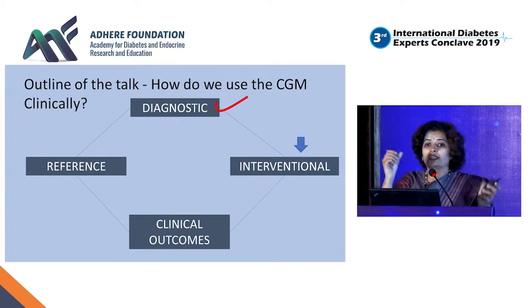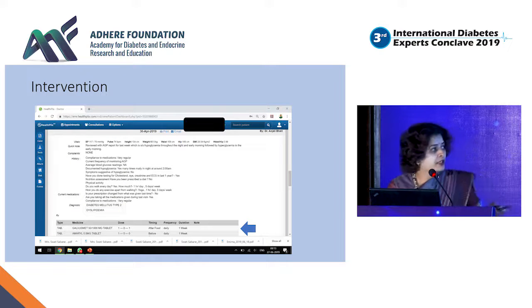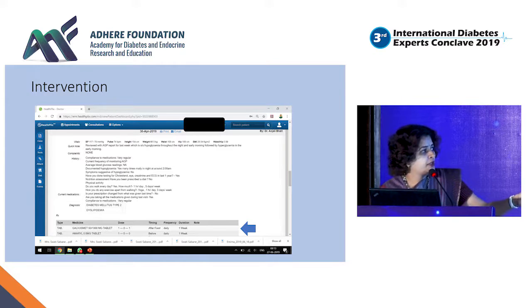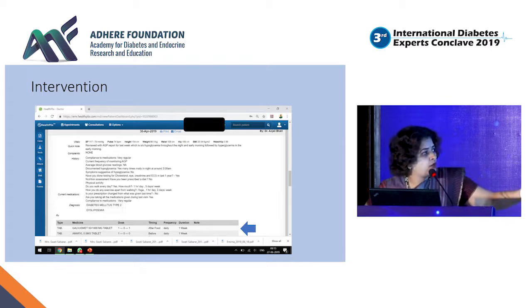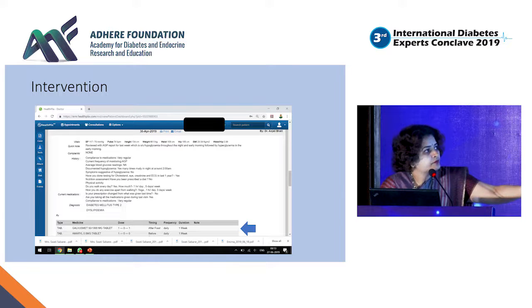Okay, I diagnose the variability is small, the interdecile variability high. So what? So what's the next step? Look at her prescription. She was on glimepiride, metformin, pioglitazone, metformin, right? We stopped her pioglitazone, put her only on one metformin gliptin combination and a small dose of sulfonylurea. Then what did the intervention do? This is her intervention graph.